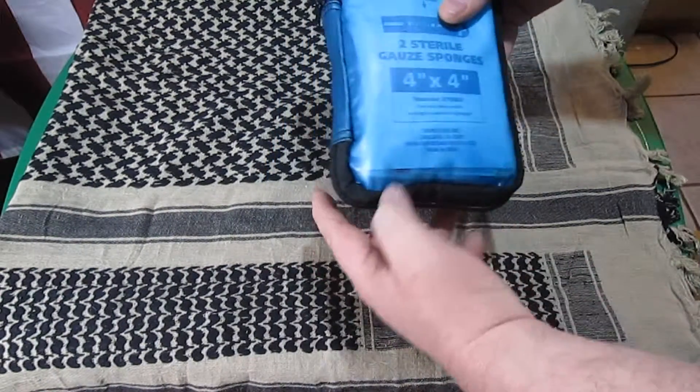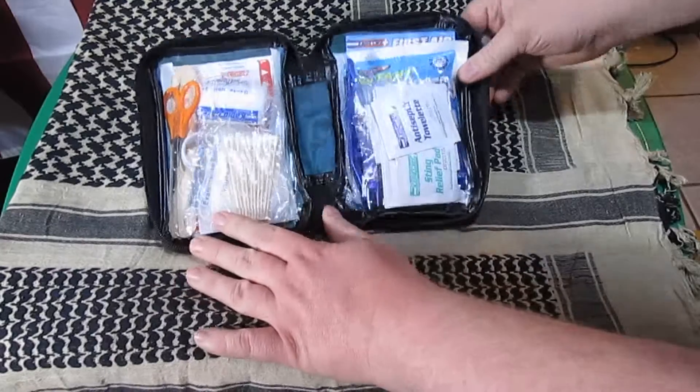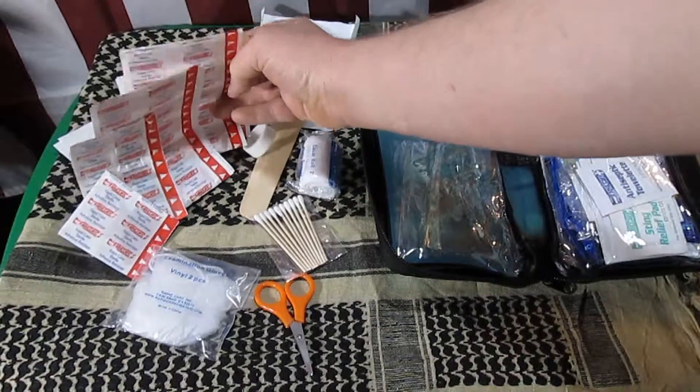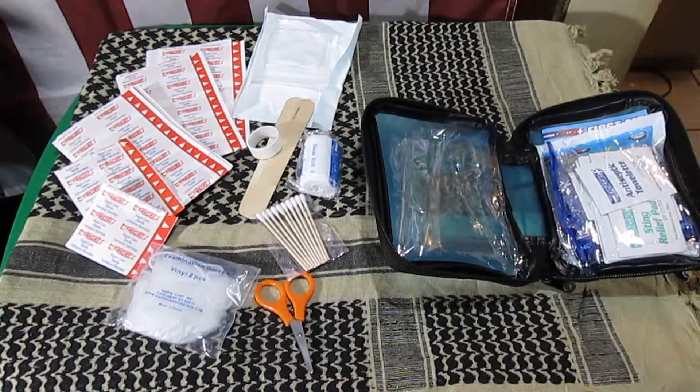It has a blue soft shell case and dual zippers, opens up. Clear pockets on both sides. On the left side you just have your various bandages, quite a few — probably the bulk of the kit. I think that's what 50 of the 67 comes from.